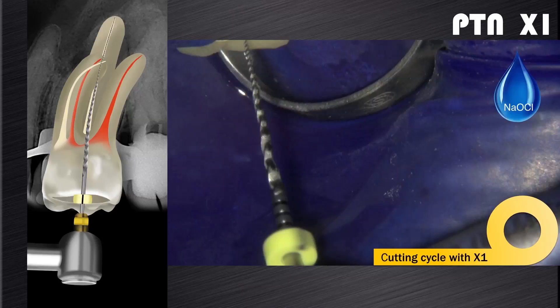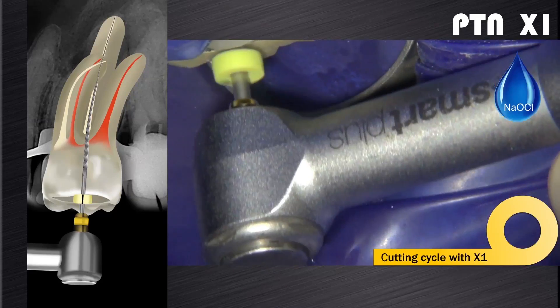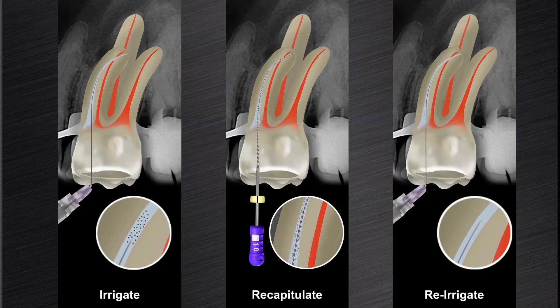When dealing with wider canals, for example the palatal root canal in this clinical case, we often find that the X1 will follow along the glide path in the presence of sodium hypochlorite, and usually in one cutting cycle it will easily reach working length. The canal is then irrigated, recapitulated, and re-irrigated.